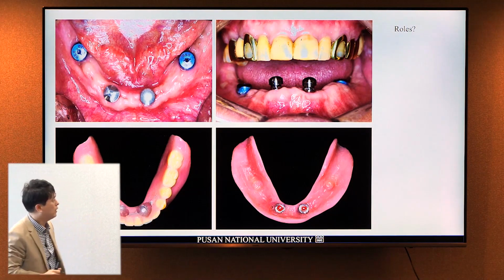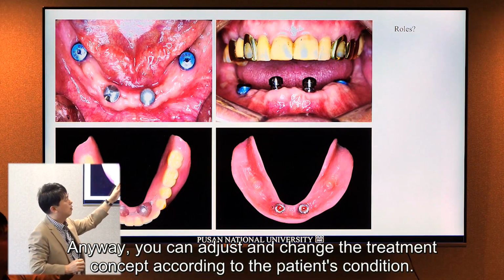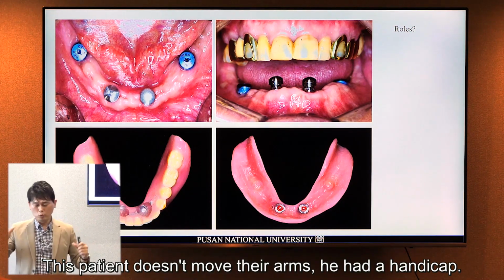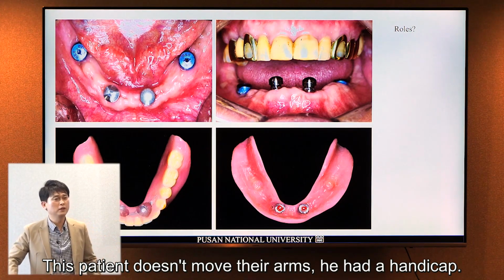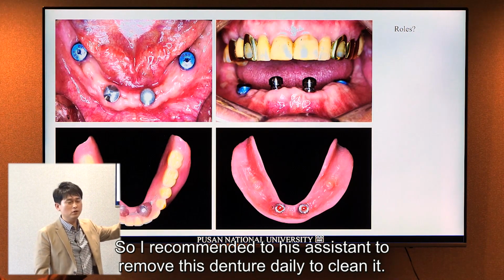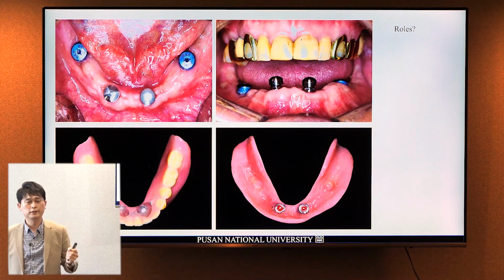Anyway, you can adjust. You can change the treatment concept according to patient condition. This patient can't move his arm. Yes, he had a handicap, so I recommend his assistant to remove this denture every day and clean it.